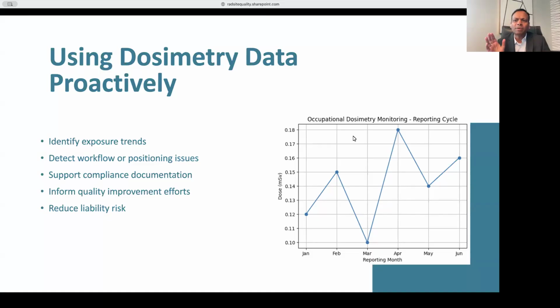So this is always a topic at the hospital level or at the imaging center level. This is always a topic in the radiation safety committee meeting, where, as Chris mentioned, if an employee is trending, even if they are not passing any thresholds, at least they are trending. That's the reason why most imaging centers and hospitals have two ALARA levels. One is a much milder one, ALARA level 1, which would be even 10% or less of the threshold.